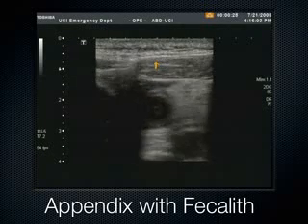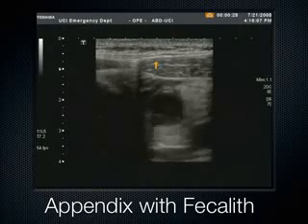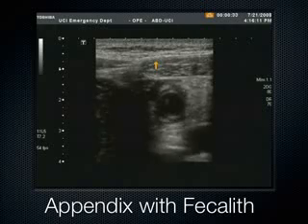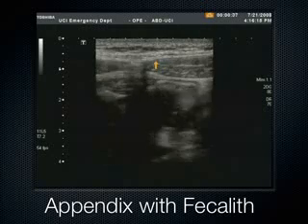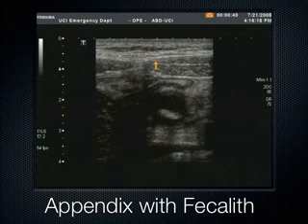Here is one last example of another patient with appendicitis. We can see here, this is the abdominal wall musculature. Again, this theme keeps coming up over and over again. Here's psoas, somewhere down here, smushing this appendix between the two muscle structures. I think psoas is actually over here too. I see it over here. And this one's got a little fecalith right there. You see that? Which literally means poop stone. That's inside the appendix.